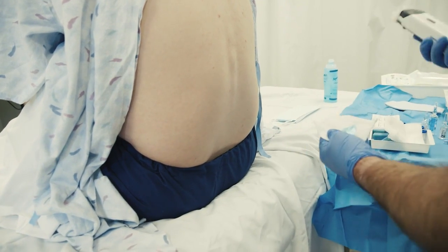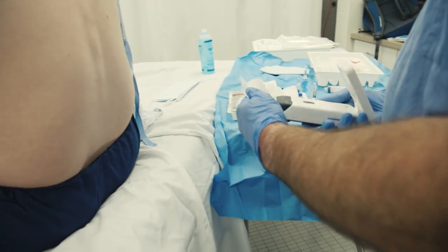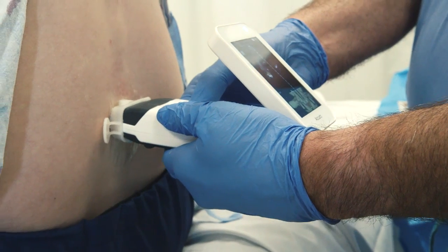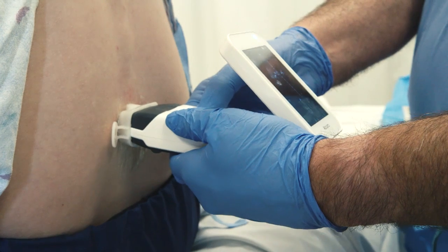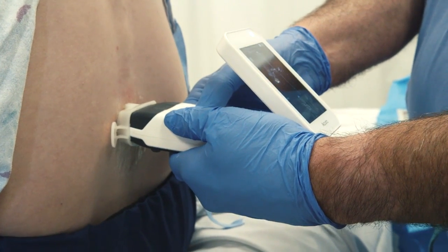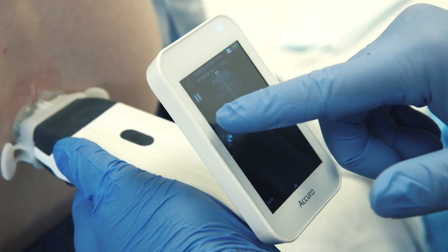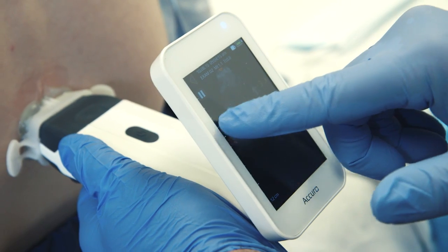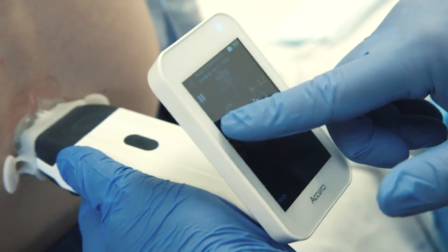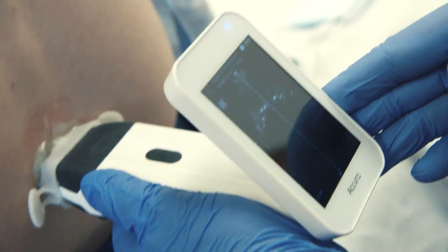Once the spine preset is selected, apply ultrasound gel to the lumbar spine area and scan in the transverse orientation, taking care to hold the Acuro perpendicular to the imaging surface. Adjust the brightness and zoom controls as desired; these controls are semi-transparent until touched by the user.